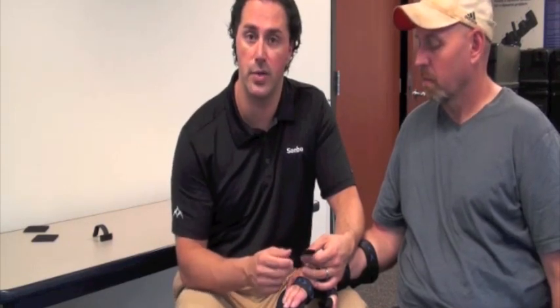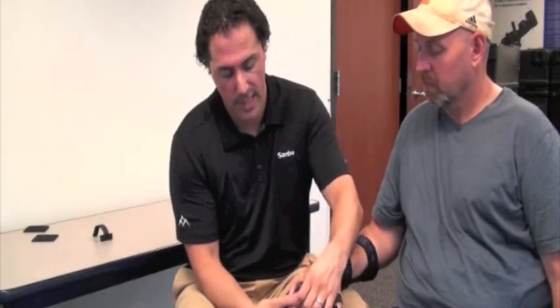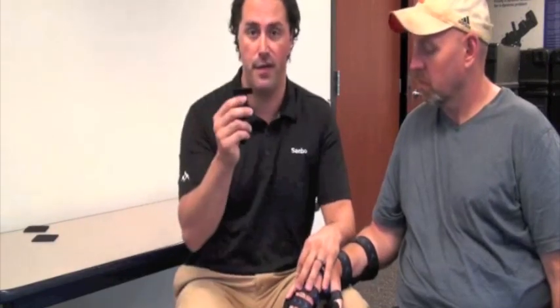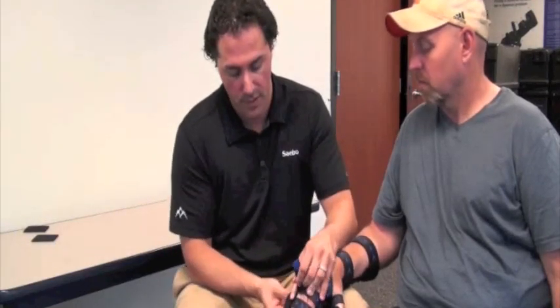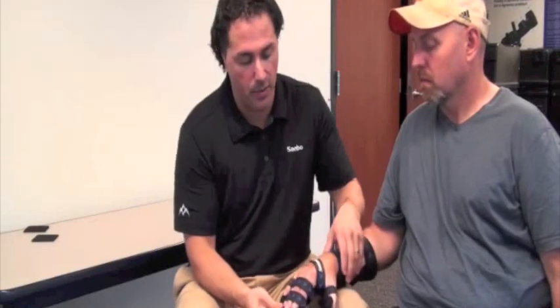If Tony were using a small or medium Sabo Stretch, we would want to trim the straps by a quarter to a half an inch. I'm going to put that second strap in and attach it just distal to the PIP joint. And finally, we're going to put the fifth digit strap in — it slides into the groove, connects, and then you can stabilize the fifth digit. So that's out of the way.